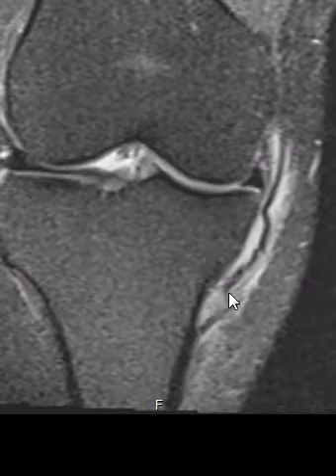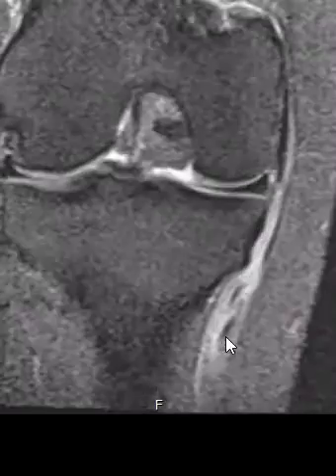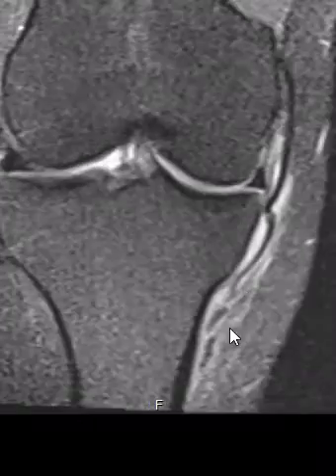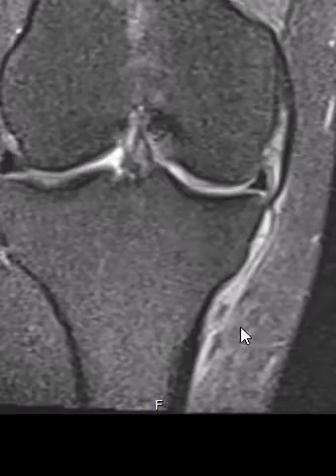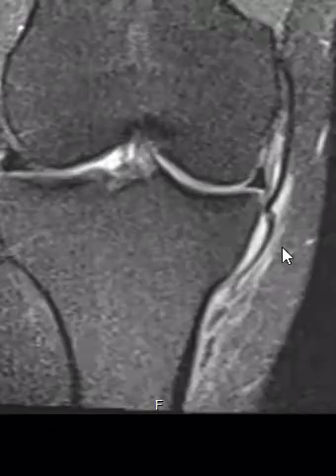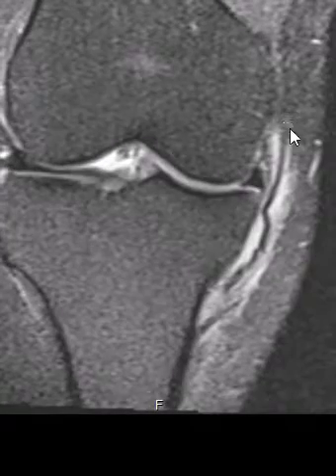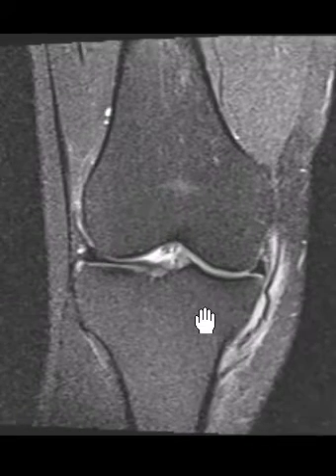You can see fluid surrounding it. It also surrounds these other structures — two little dots down here going down to attach just below the medial collateral ligament. These are the pes anserine tendons — two of the three components. They may be sprained but are not completely torn, and they are just outlined by the fluid associated with this distal medial collateral ligament rupture. That is it — thank you very much.